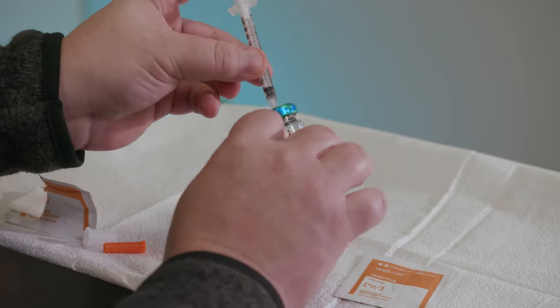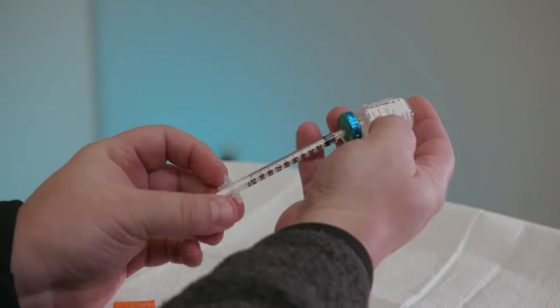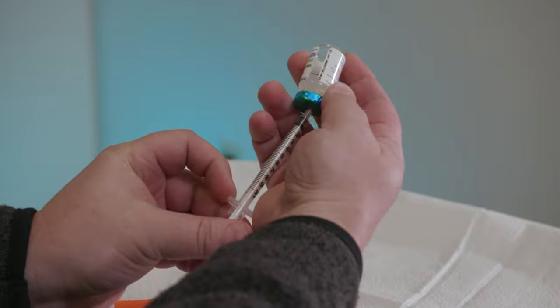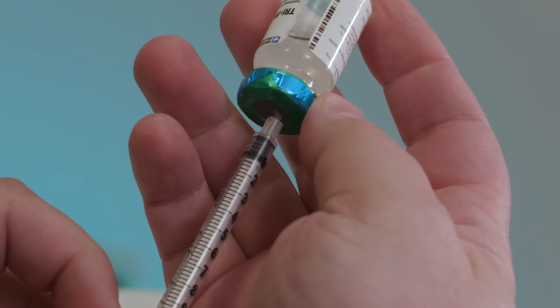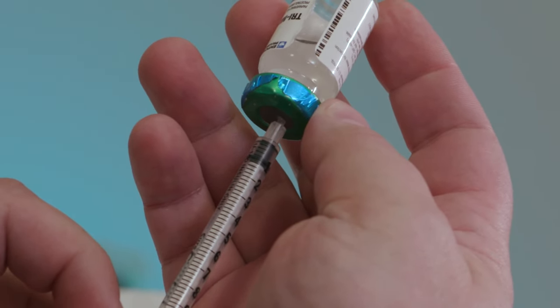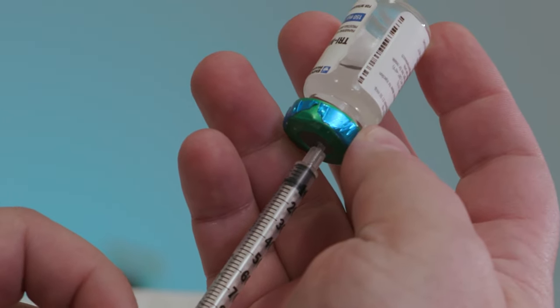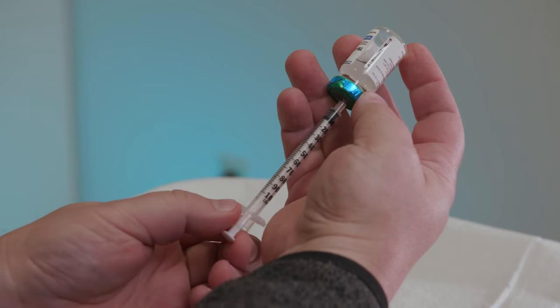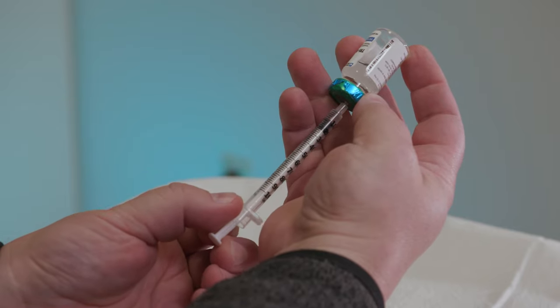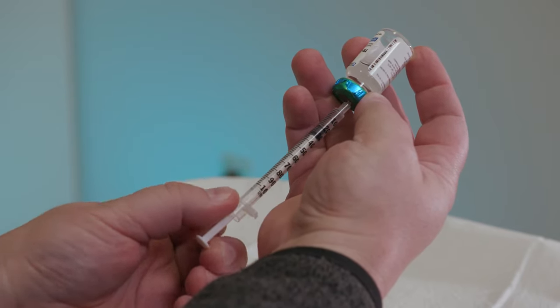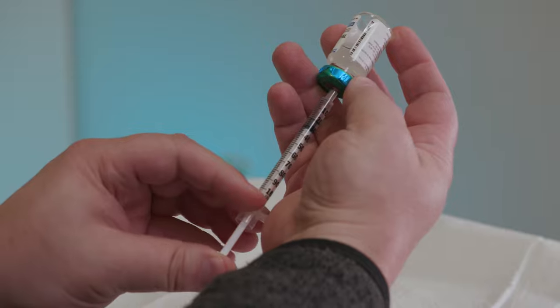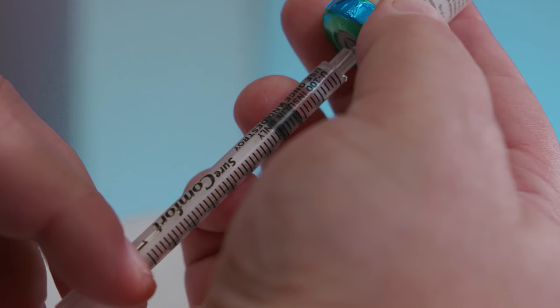Next, turn the vial and syringe upside down. Don't let go of the vial, or the needle will bend. Make sure the tip of the needle is in the medication. Turn the syringe so you're looking at the numbers and lines. Pull the plunger down past your prescribed dose. Then, slowly push it back up to your dose. This helps remove any air bubbles.